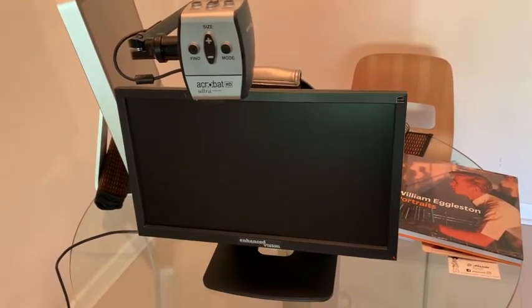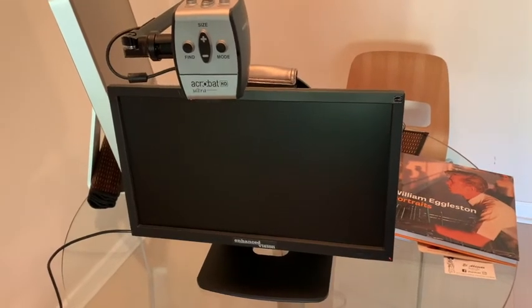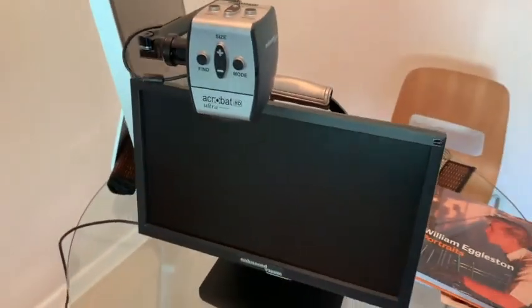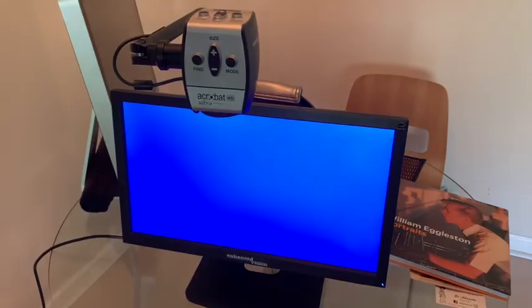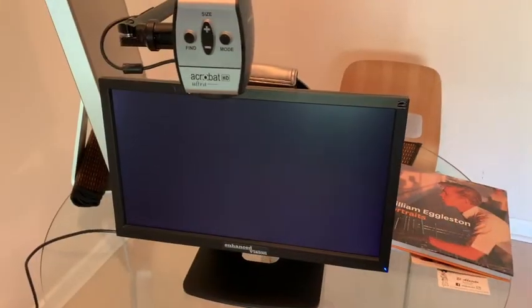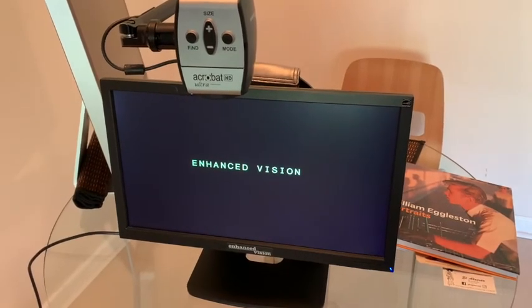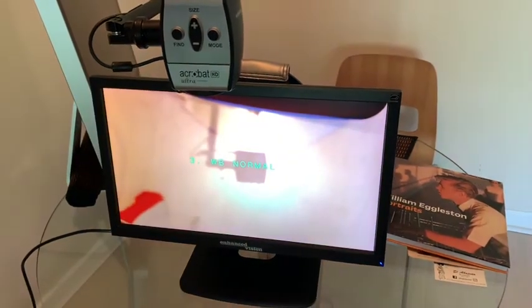We'll go through some settings, starting with how to turn this thing on. There's the switch. It takes a little while to get going, and here we go.